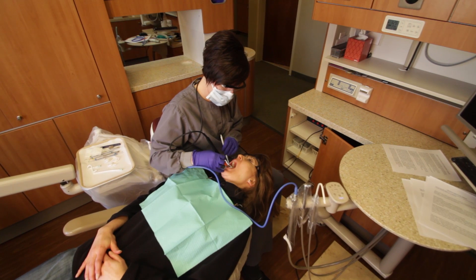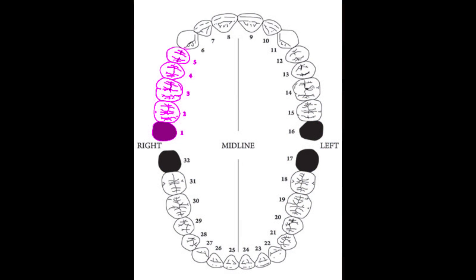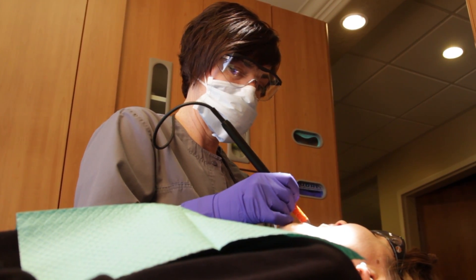Have the patient turn their head slightly to the right. Finish the maxillary arch by power scaling tooth numbers 1 through 5 buccal and lingual surfaces, then 32 through 28 buccal and lingual surfaces. This is the most proficient way to use the BlueBoa while power scaling.